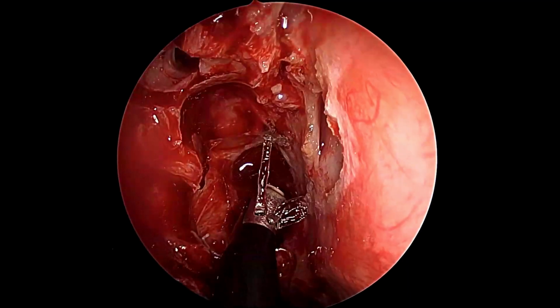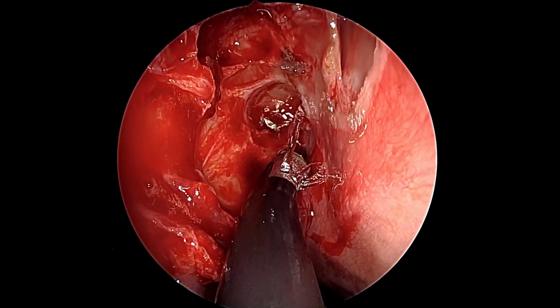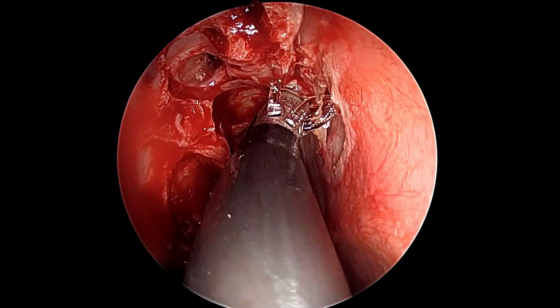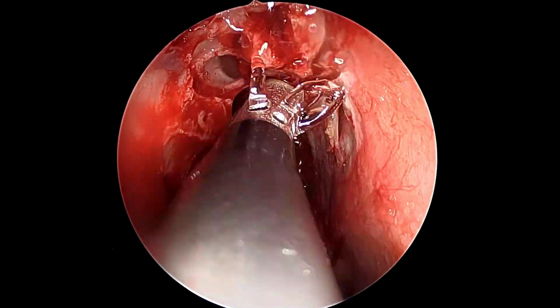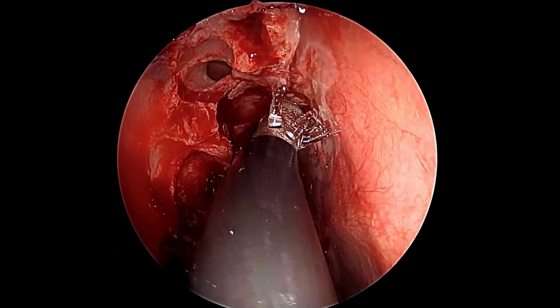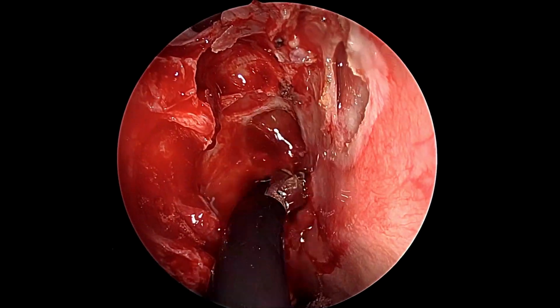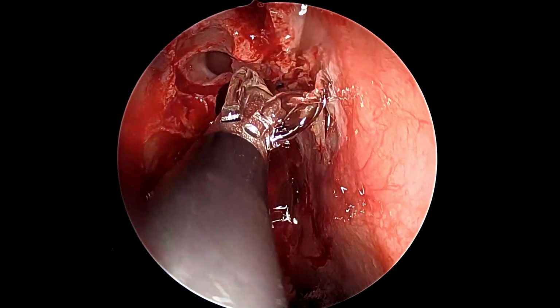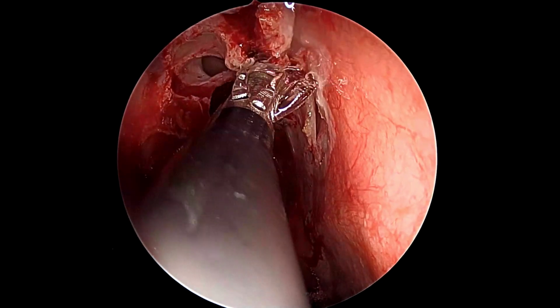So once more septations have been taken down with the through-cut, here we start using the coblation wand again to devitalize a reasonable amount of the mucosa around the defect that is just in front of us. We can see here that we use the irrigation on the coagulation wand to a maximum to keep our surgical field clean. We do not like charring here, nor do we like blocked wounds. We can see the meningocele layer here very clearly in front of us, and that is why a lot of bone around it needs to be bared and mucosa devascularized.